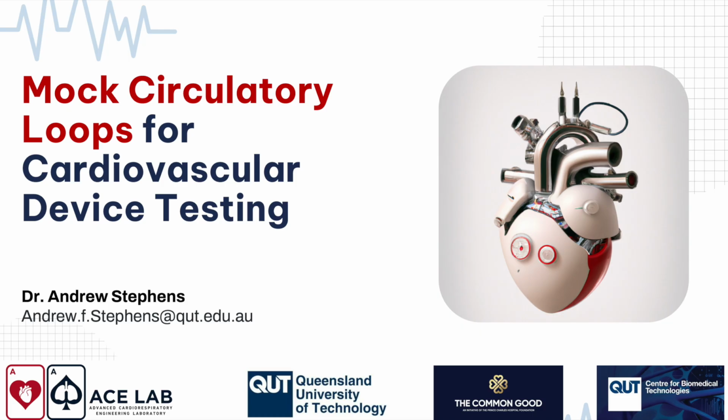And so there are many ways to actually achieve the pumping of the heart. Some methods include pneumatics. Some include things like linear pushers, hydraulics, and rotary. So what you can see here, on the right-hand side, the nice photo is supposed to be a video of our mock loop pumping up and down.